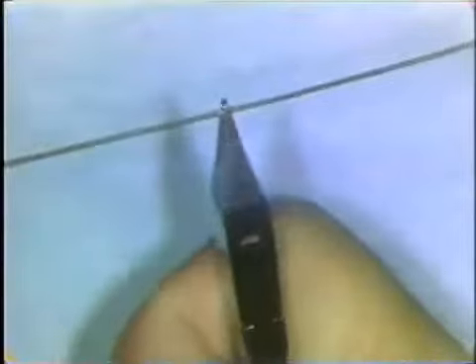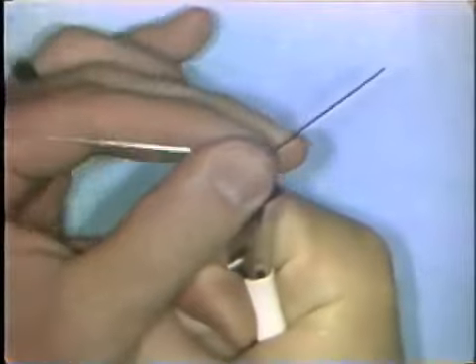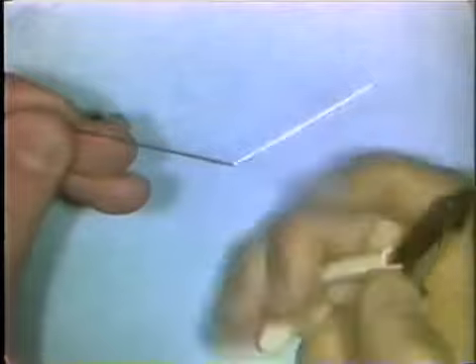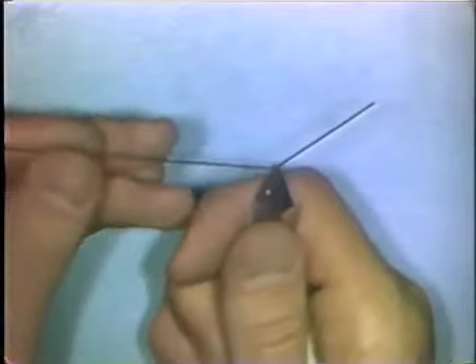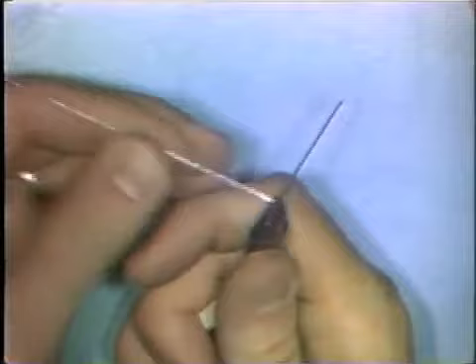You orient the wire at 90 degrees to the plier beaks. Place your left thumb or left finger right on top of the wire in contact with the wire and the plier beaks and apply pressure towards the round beak. You push directly on the wire and also directly on the beaks of the plier. You make the bend about 30 degrees or 1/3 of the way, usually. Check it on a work model that you're constructing and place the beaks back in place and complete the 90-degree bend, again pushing directly on the beaks of the plier and on the wire itself.